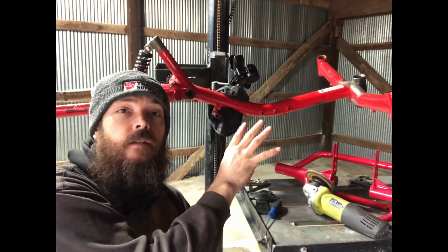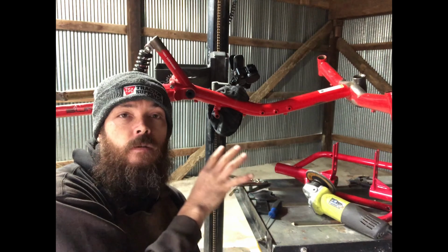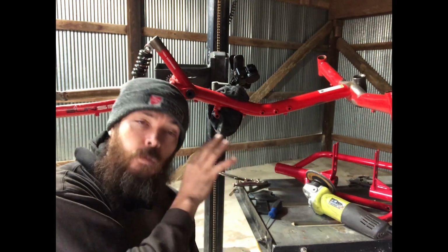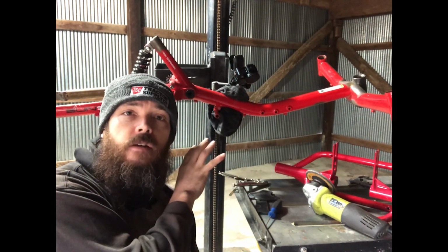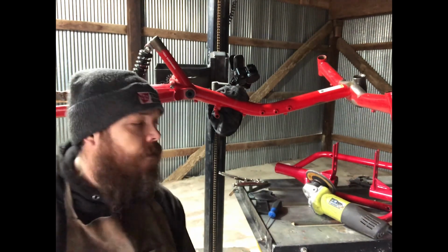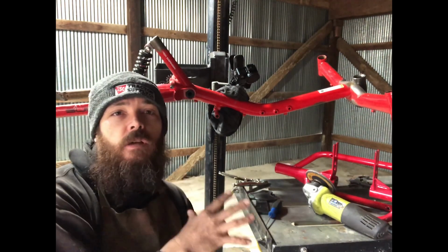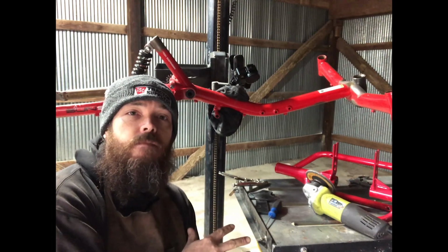We're continuing to show you how to build your very own QMX, how to build your own off-road wheelchair. In some people's cases, they're just going to take their regular recumbent bike and convert it into a four-wheeler. Call it whatever you want. We're going to call it a QMX. If you haven't seen my other videos already, go ahead and check those out so it gets you all up to date on what's going on today. Otherwise, we're going to get right into it. So stay tuned.